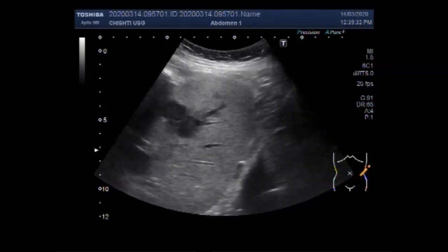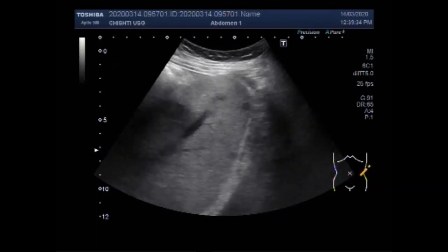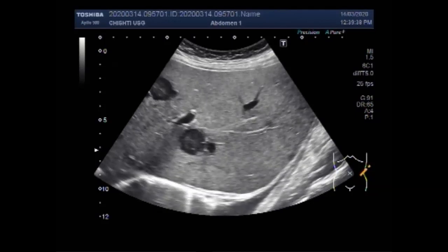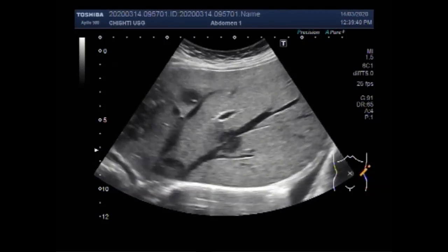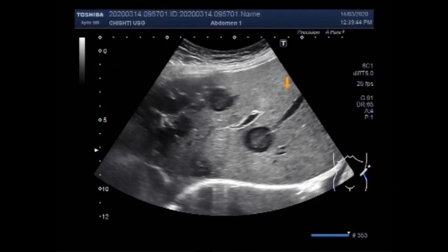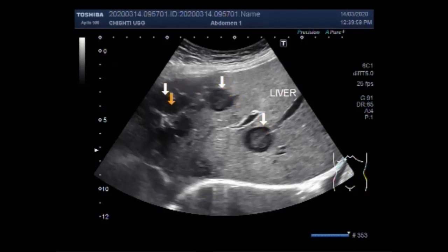Now you can see the liver, and you can see these metastatic lesions predominantly in the left lobe of the liver. However, some lesions are also seen in the right lobe of the liver. These are the metastases.